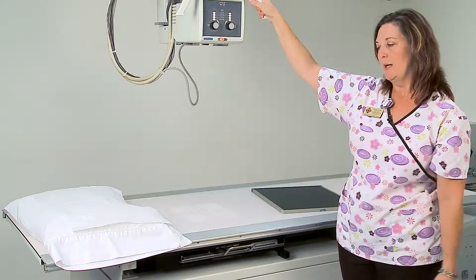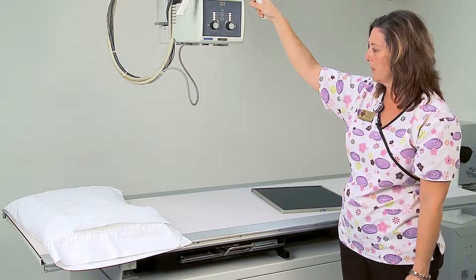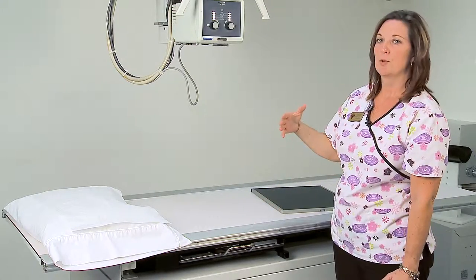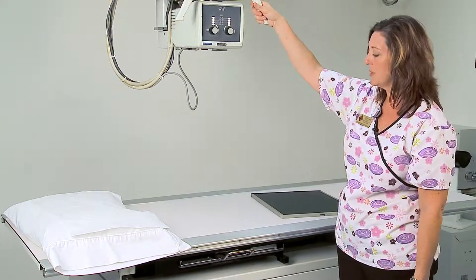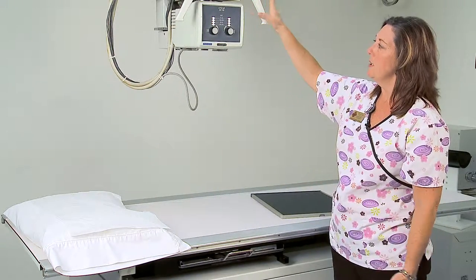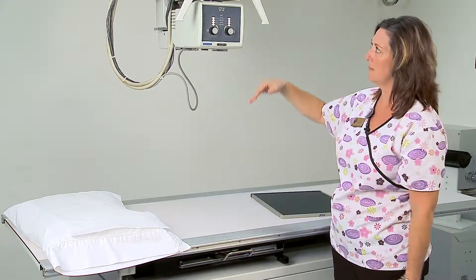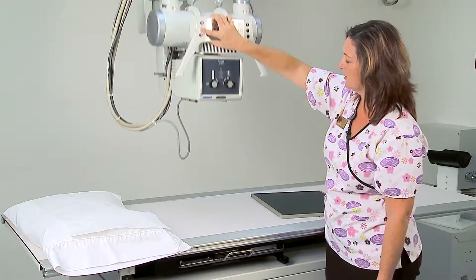In radiography we take two images of all parts of the anatomy — one generally in the AP position, from top to bottom, and another across the patient, a lateral position. If the patient is unable to turn onto their side, we can manipulate our tube to help get that lateral projection. I'm going to bring the tube down into a working area so we can see it a little bit better.